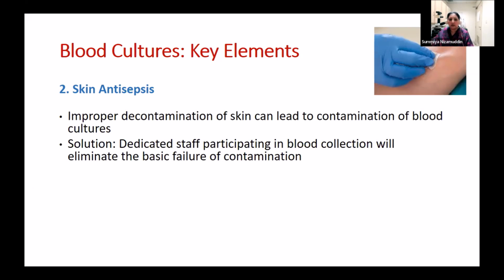So this one single step can actually help us rectify all the further consequences that might arise because of blood culture contamination. So improper decontamination of skin can lead to contamination of blood cultures, and it's always better that dedicated staff are nominated who would actually collect these blood samples properly. So this would ensure that contamination is avoided.